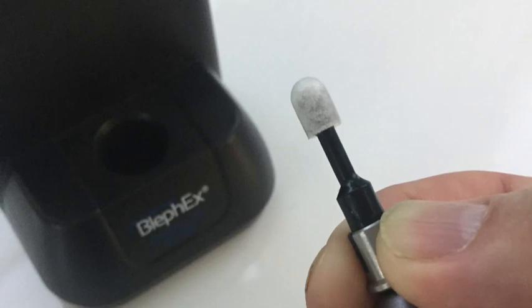So just have them tip back, tip towards me just a little bit, hold a tissue here so you don't flood their clothes, and just squirt right in the eye. Have them blink a few times, look up high, blink a few times, and now let the patient dab their eye.